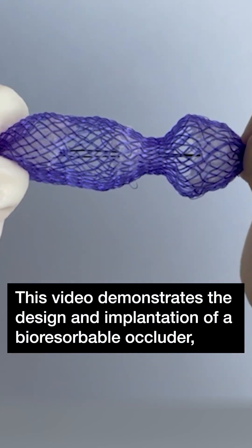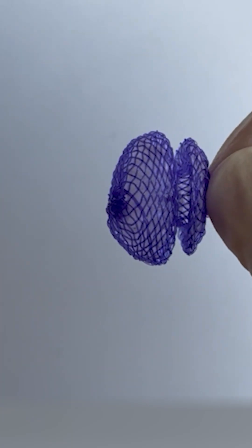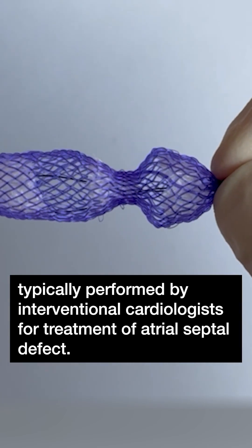This video demonstrates the design and implantation of a bioresorbable occluder, typically performed by interventional cardiologists for treatment of atrial septal defect.